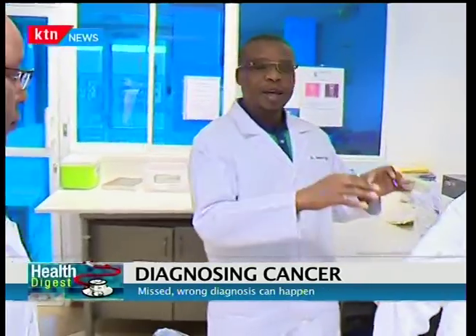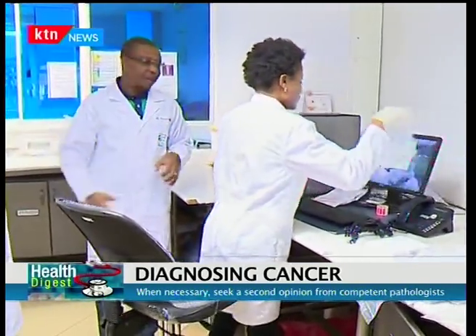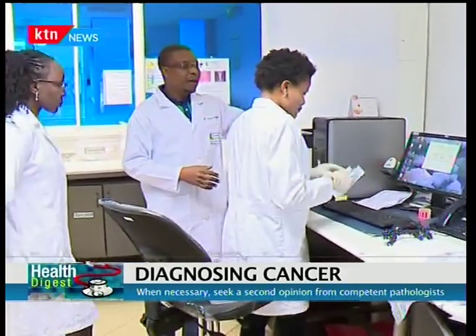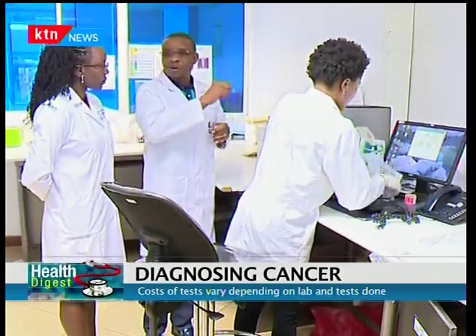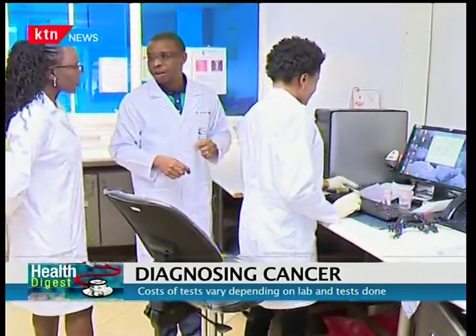Now the next step is what we call accessioning. Accessioning means the details of the patient will be entered on the system. In our scenario, once it's entered, we become paperless. The papers stop here, the rest of the lab is paperless. So this is the station where they receive the details. The doctor's details will be entered on the system, the email address, and so on and so forth, because after this, the results will go according to what is on the request form and what is on the details there.